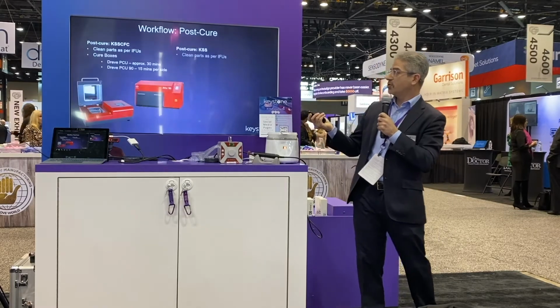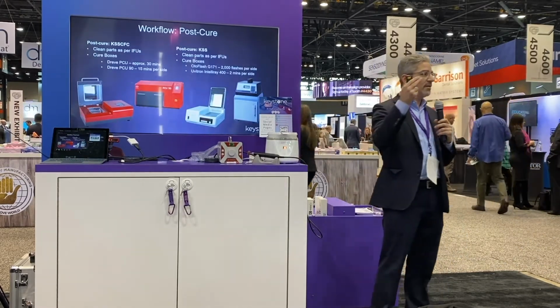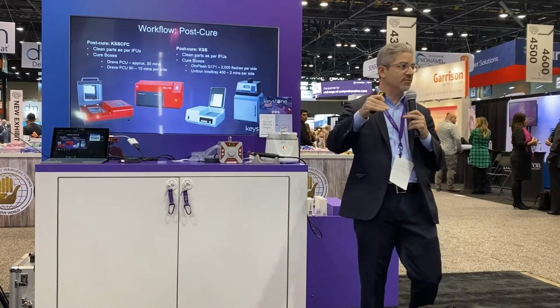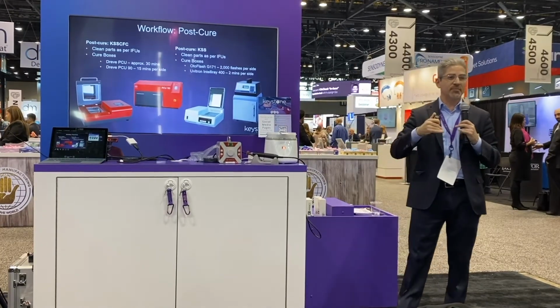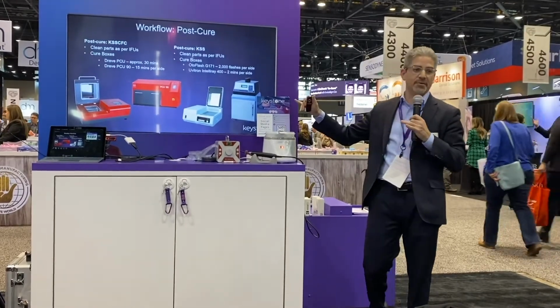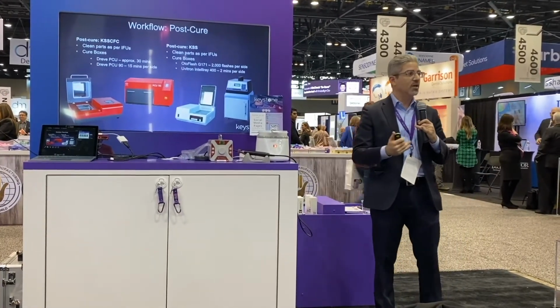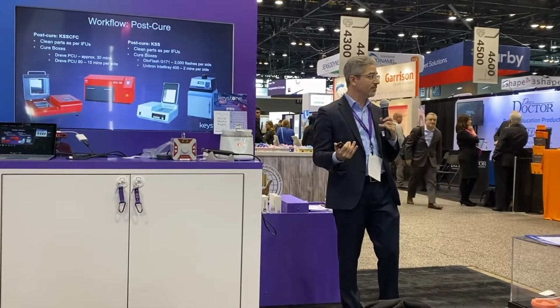All right, so for post-curing, for the Carbon system, they have a workflow that uses the 2 Dreve boxes. So we've done validation work to make sure the Keysplint Soft is working in that workflow. However, we've also taken the next steps for both our tinted version and for the Carbon version of testing some other very popular cure boxes that are out there to ensure you have choice, okay? People have different workflows. We are currently validating probably somewhere between 8 to 10 boxes for post-cure.